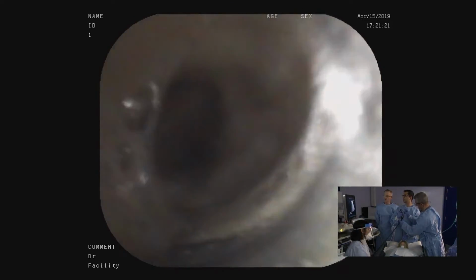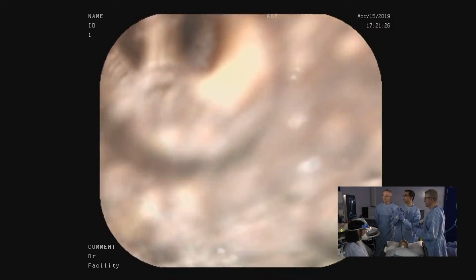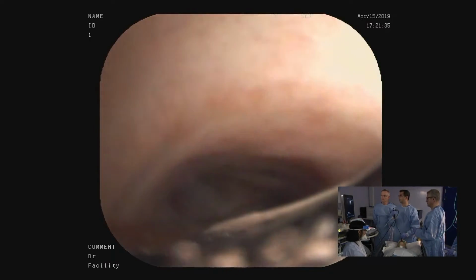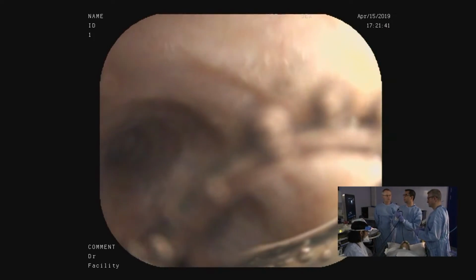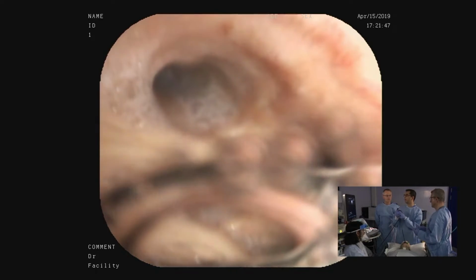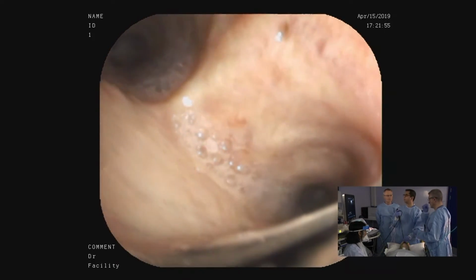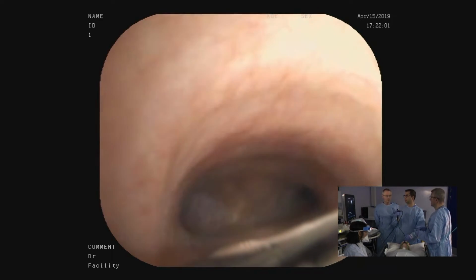For staging, with the multiple nodules in your staging classification, this gives you T4 disease? Yes, there are multiple nodules on the right lung. There is a small nodule on the left, just about 5 millimeters, which could potentially be suspicious. However, in view of multiple ipsilateral lung nodules, it's going to be T4, definitely N2 seen on the CT, and potentially N3 at station 4L, the AP window. However, there are multiple bone metastases, including ribs, that gives M1c. So it's T4, N2, N3, M1c.